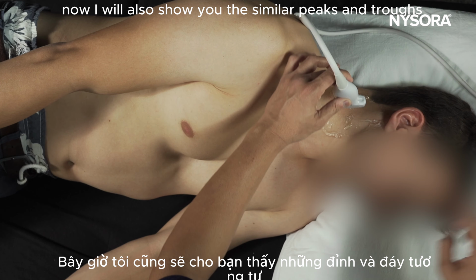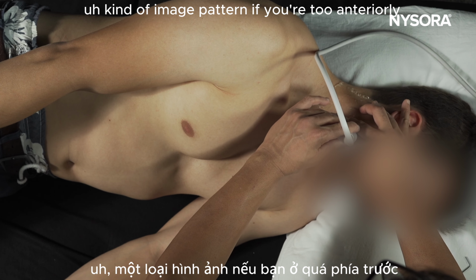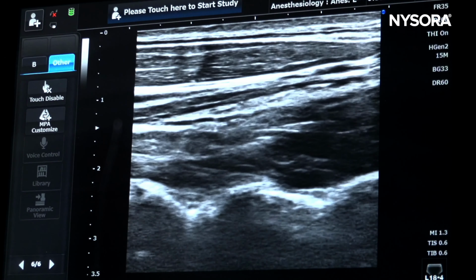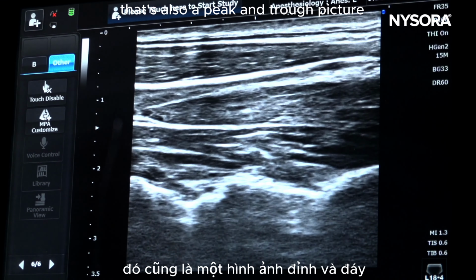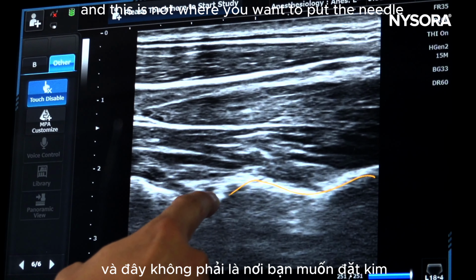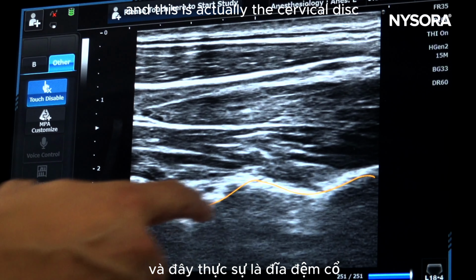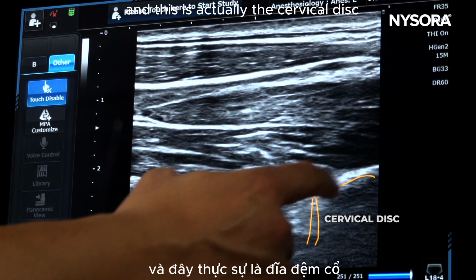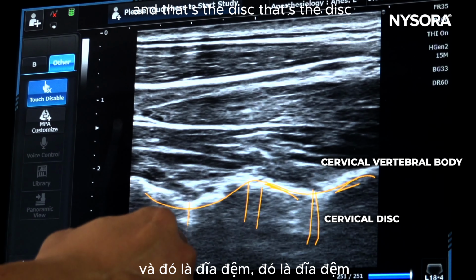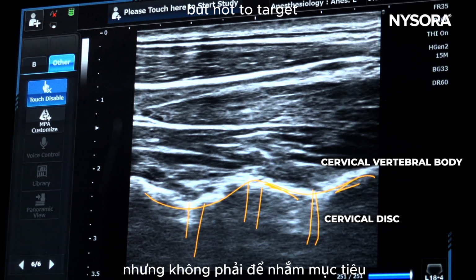Now I will also show you a similar peak and trough image pattern if you're too anterior. And now you can see in this particular image here that's also a peak and trough picture like we saw for the facet joint column. And this is not where you want to put the needle, because we're way too anterior, and this is actually the cervical disc along with the cervical vertebra. So this is a vertebral body, and that's the disc, that's the disc. So this is basically a picture that you want to see but not to target.